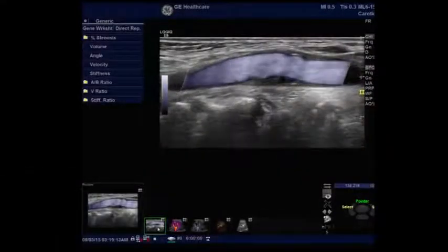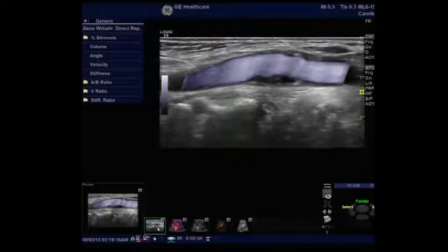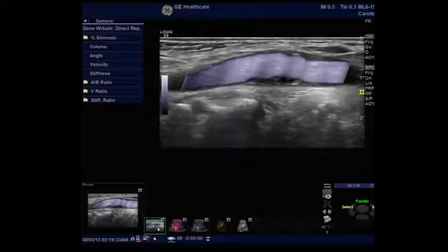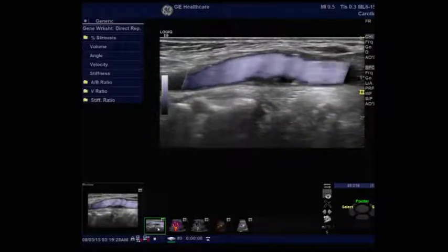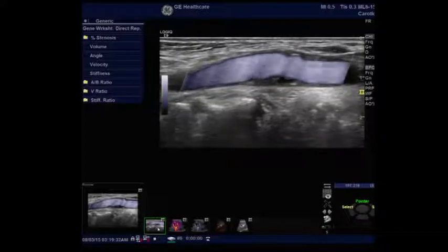What are the differences between B-Flow and B-Flow Color? B-Flow Color is based on Doppler technology, which is similar to power Doppler, but with the advantage of higher spatial resolution. This higher spatial resolution gives B-Flow Color better hemodynamics and less color overwrite compared to power Doppler.